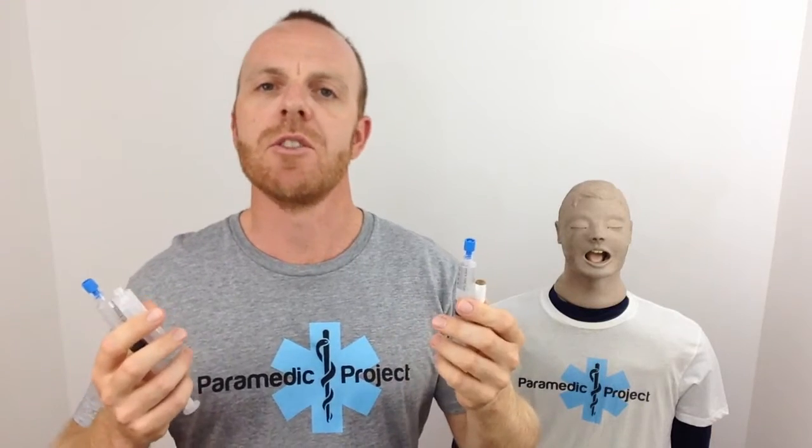Now, it's just like any other skill, like intravenous cannulation. You have a mental picture in your mind of the equipment you need to prepare before you actually do the skill, and drawing up a drug's no different. There's equipment you need and you just have to become familiar with them. So that's the first big point.